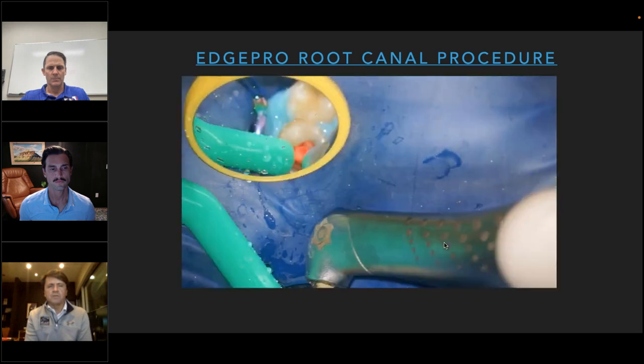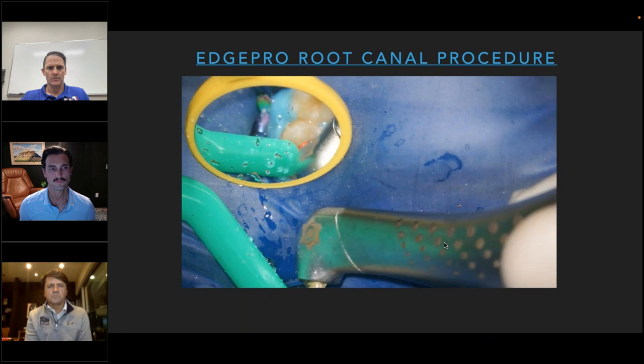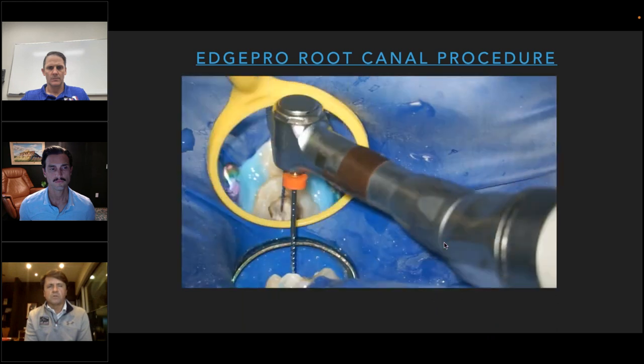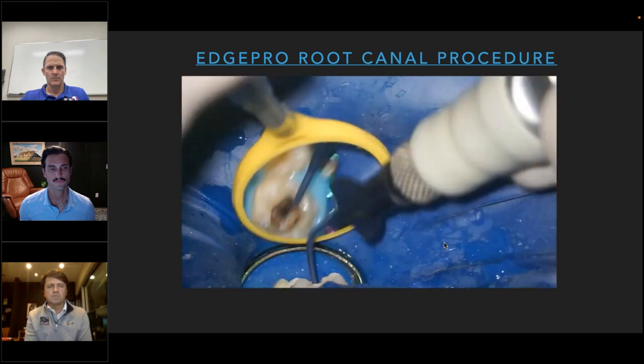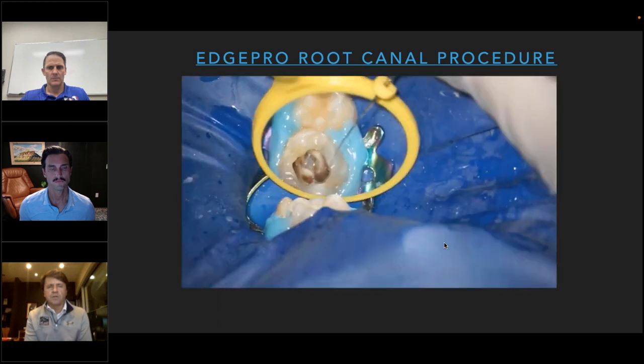So here I'm running the laser in the chamber right there. Now we're doing a little more coronal enlargement. Standard irrigation, microsuction. So bear with this. I'm going to get working lengths real quick.